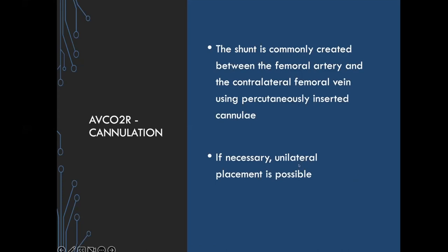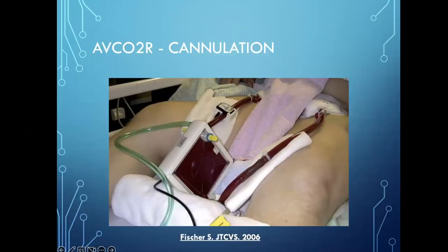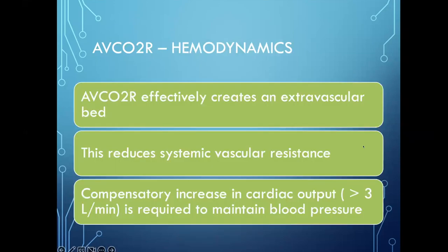This is just to show again in a patient how you place that. This is your flow measurement instrument. The patient needs to have stable hemodynamics. And in many patients, you actually need some catecholamine support to maintain the shunt. So there is always some increase in the cardiac output driven by medication, of course, but it's not that large a dosage you need in patients if they are hemodynamically stable.